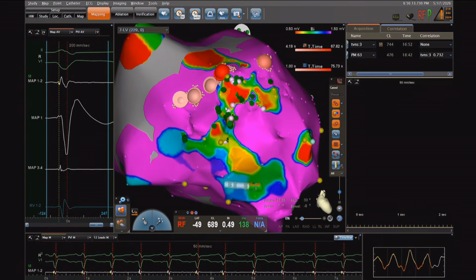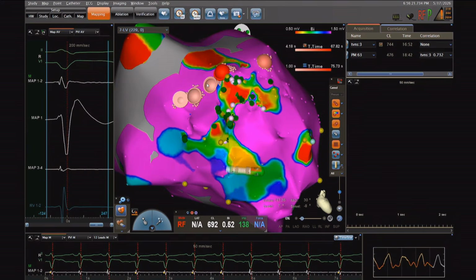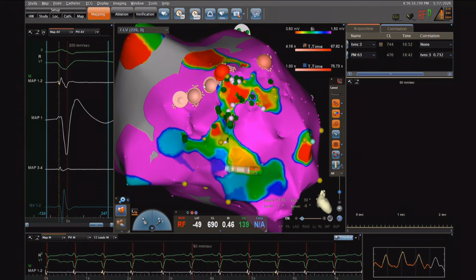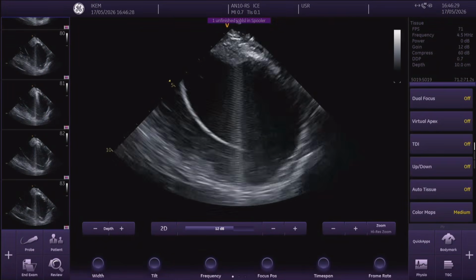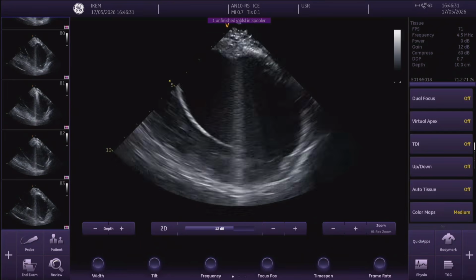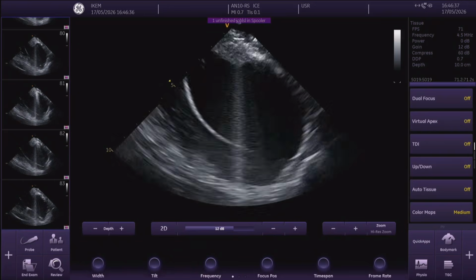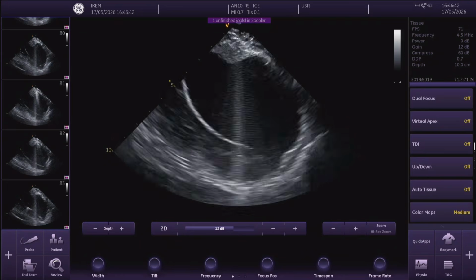And at the same time, we know that the patient has also an ischemic, so it's a mixed ischemic and non-ischemic in this patient. The origin in the right ventricular outflow tract, of the left ventricular outflow tract and the coronary cusp is very specific of what we see in non-ischemic. If we can see echo, intracardiac echo, you will appreciate again that there is a huge aneurysm anteroseptal, and with thinning of the wall, and we have a lot of these fragmentations on the boundary of the aneurysm. So we decided to do sort of core isolation of this aneurysm.